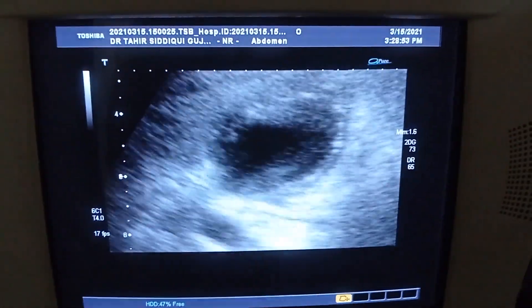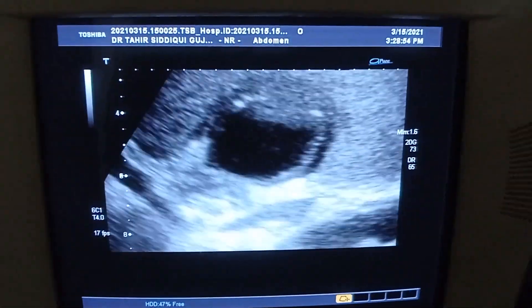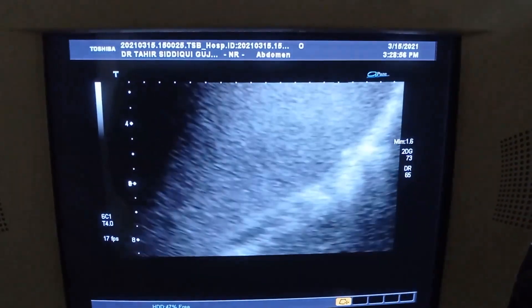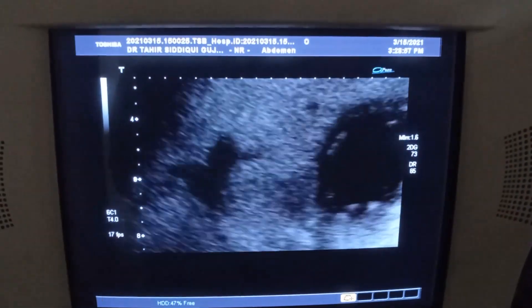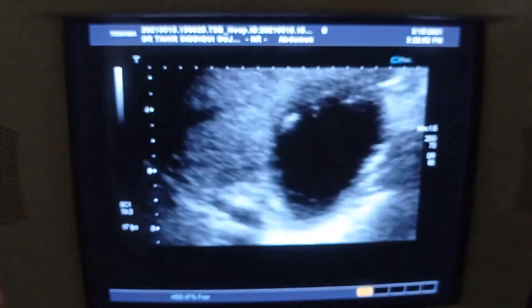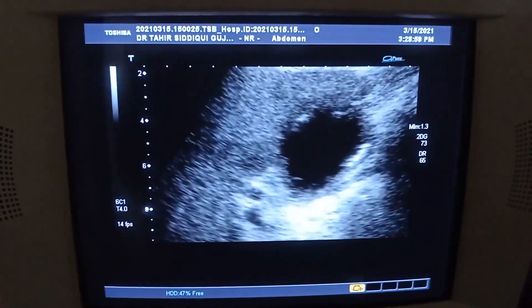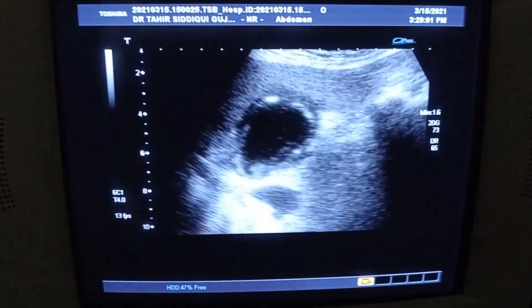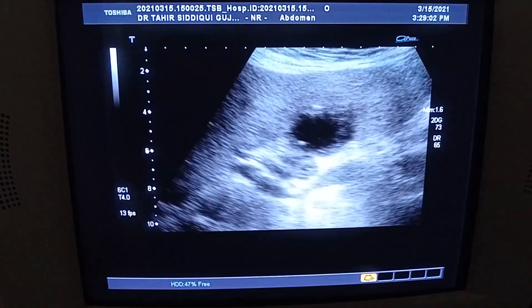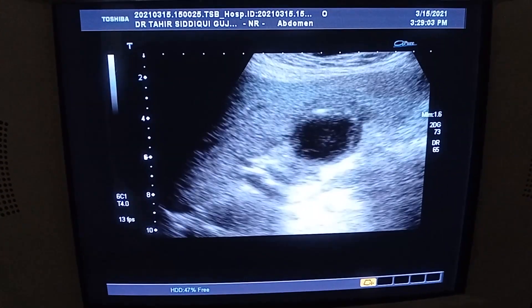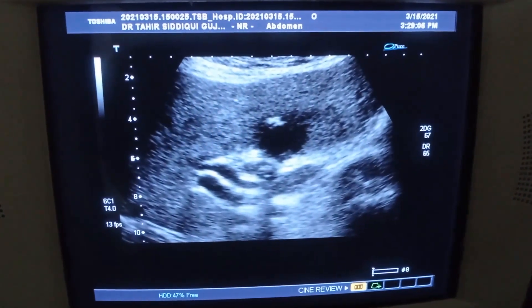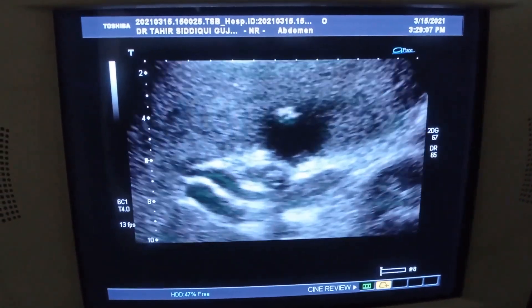This is the longitudinal section and the gallbladder is not distended. The CBD is very normal and is not dilated.